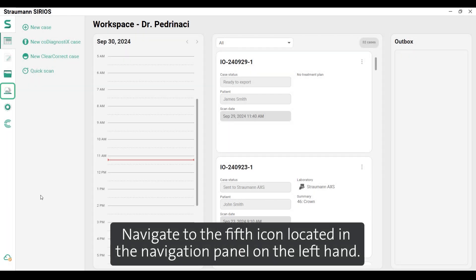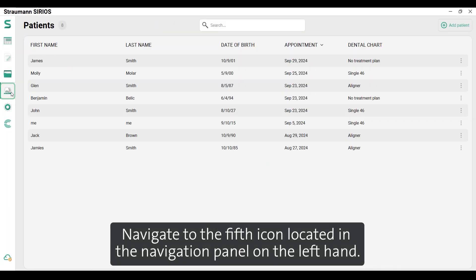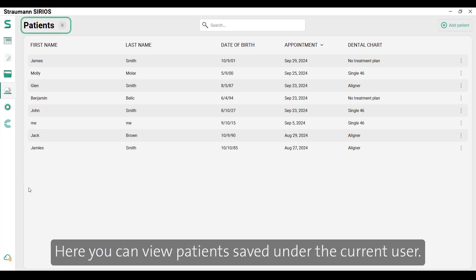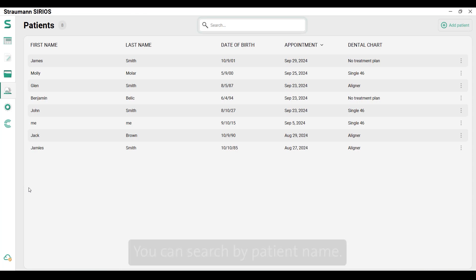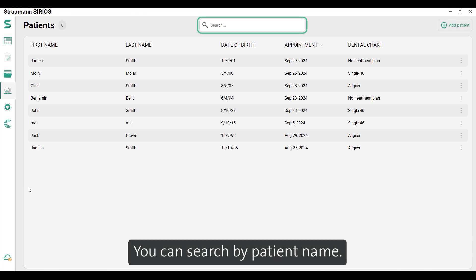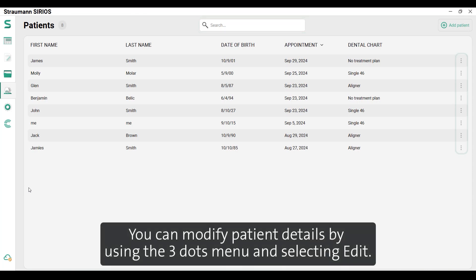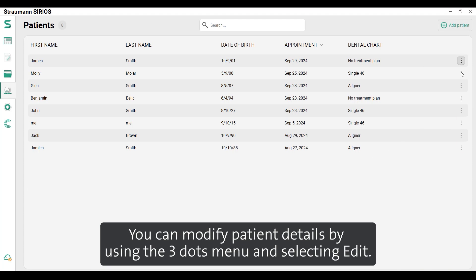Navigate to the fifth icon located in the navigation panel on the left-hand side. Here you can view patients saved under the current user. You can search by patient name. You can modify patient details by using the three dots menu and selecting edit.